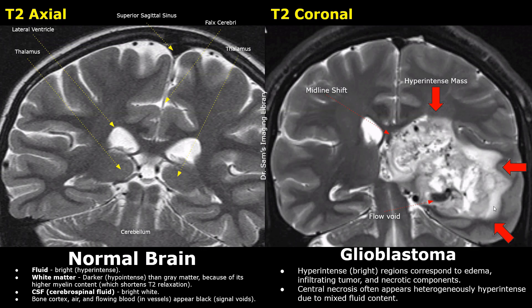Edema is also noted and usually appears more homogeneous than the mass. Due to this homogeneity, we are able to distinguish it from the mass. Ventricular compression and midline shift are also noted.